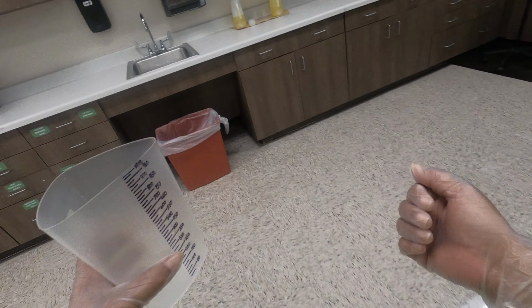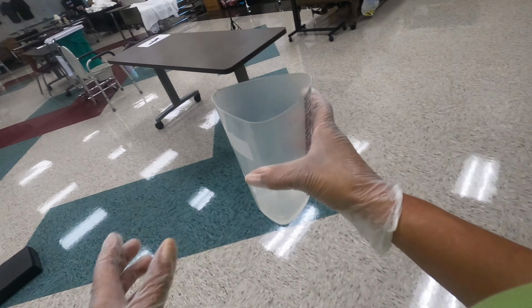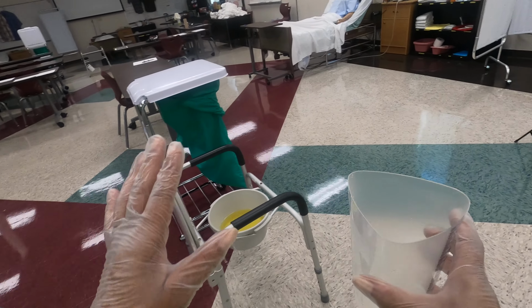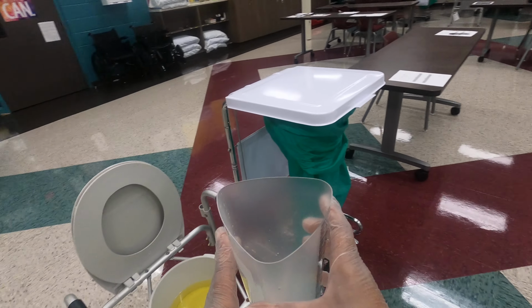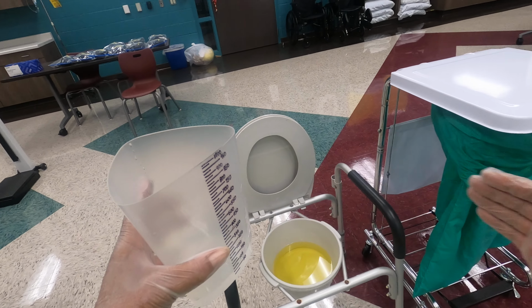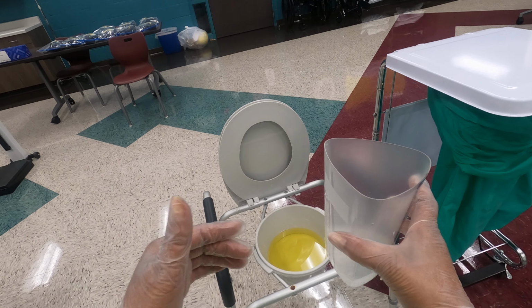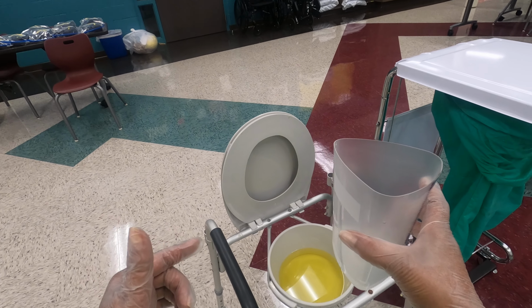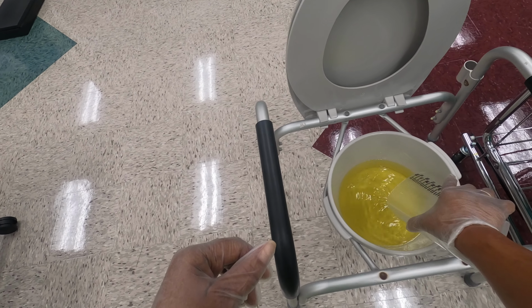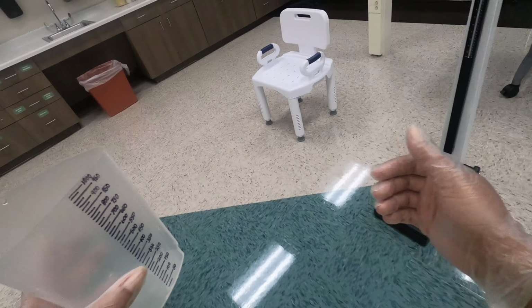Then I'm going to go to the sink and I'm going to rinse. Now, I always tell my students, look, in order to avoid temptation, right? Emptying that rinse into the sink, when you pour that water, turn off the faucet and walk away immediately, right? Walk back towards the toilet. That way you won't be tempted to pour the rinse into the sink, okay? Just like I just did. Then I'm gonna go ahead and pour the rinse into the toilet, making sure again that it does not splatter or splash.